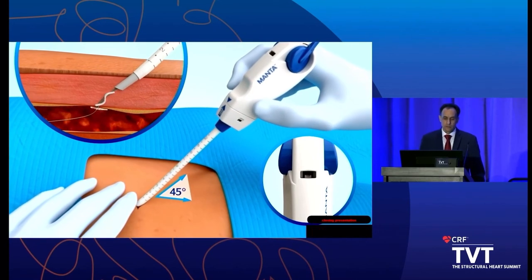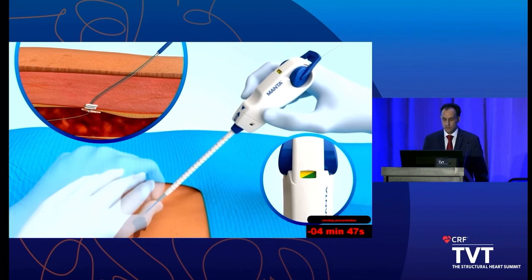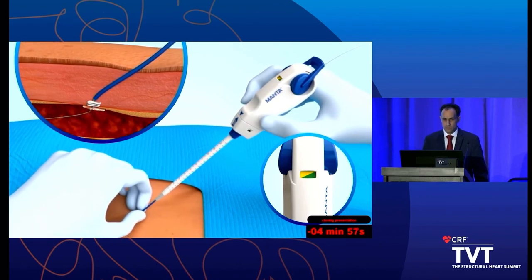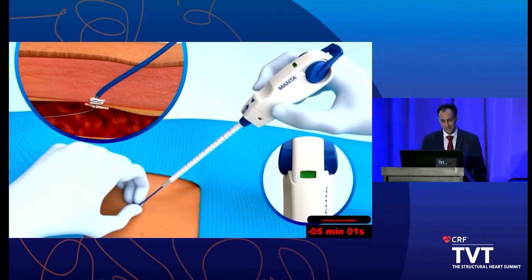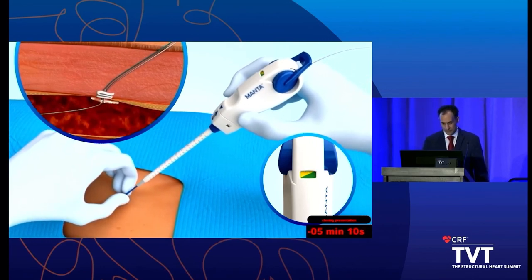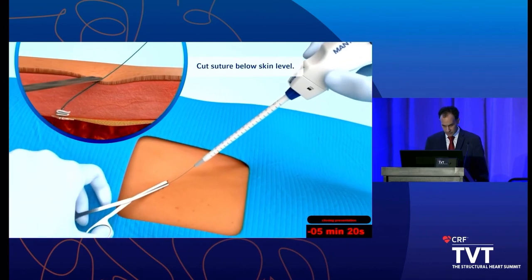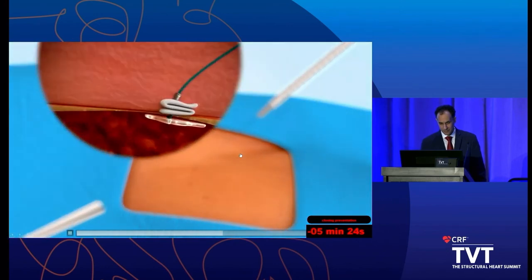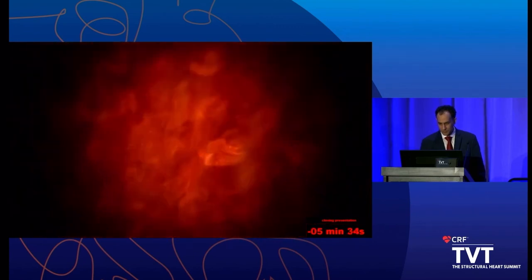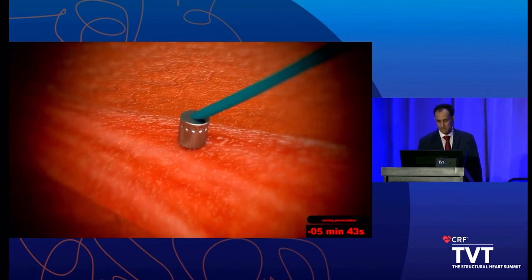Steadily withdraw the device from the artery until tension is felt and the handle indicator window shows yellow-green. Maintaining this yellow-green tension, gently advance the lock advancement tube to position the radiopaque lock. While stabilizing the vessel with the lock advancement tube, retract the device slightly until a click is heard. The access site is now sealed. The lock advancement tube may be retracted to assess hemostasis. Once hemostasis has been confirmed, remove the guide wire. The suture should be cut below skin level. The Manta anchor is low profile, non-thrombogenic, and resorbable. The radiopaque lock remains and is angiographically visible to guide future access 2.5 centimeters above or below the previous site.